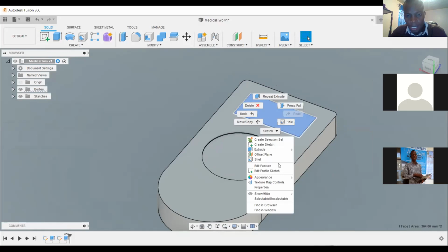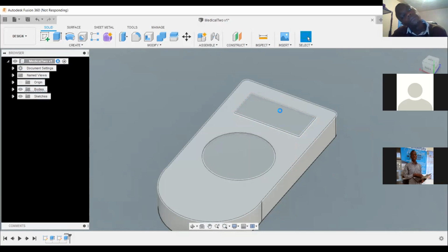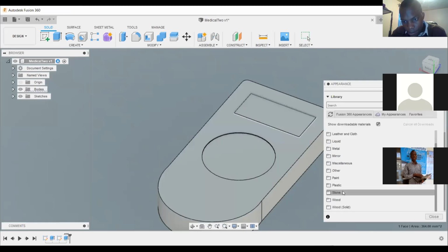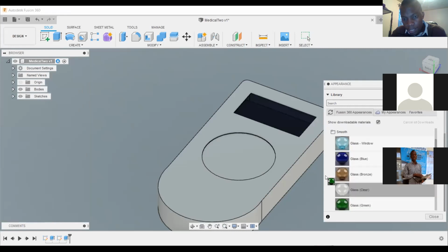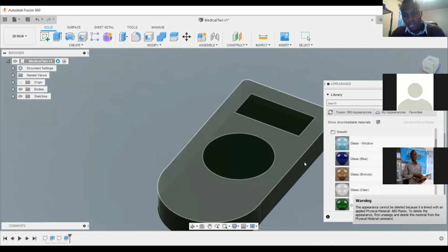Then you can change the appearance, like inside there, if you want it to be green. Whoever was asking, the LCD screen, you want it to be green. But we can, you want it to be glass. And then, okay, you want it to be green. Not the whole thing.